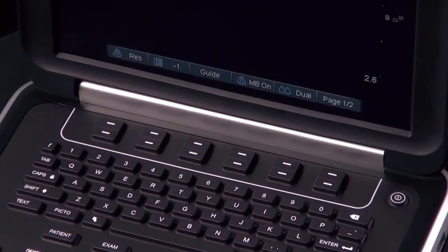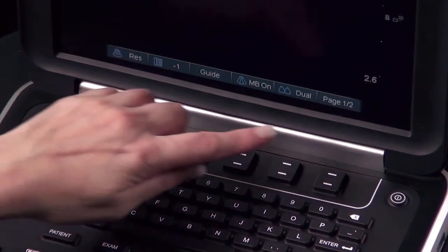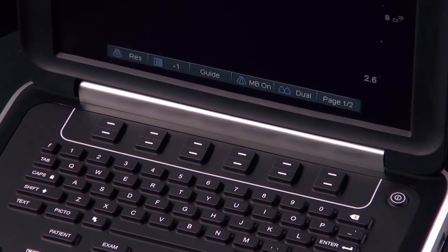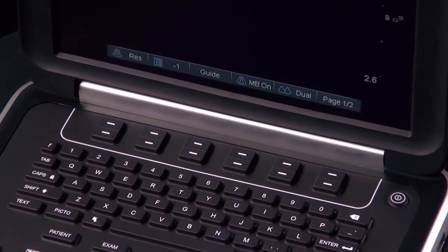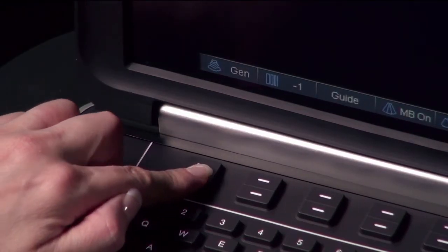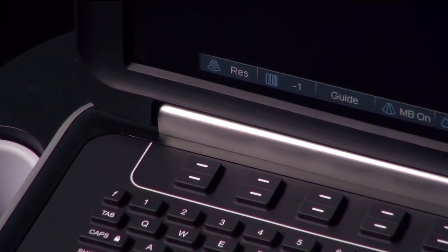At the top of the control panel are a series of six sets of two-button groups. These are the remappable controls, or soft keys. The keys are used to adjust the values of each control displayed in the context menu. The menu displayed will vary depending on the mode or feature activated. When selected, the key will cycle through a list of values, or the up-down function can be used to quickly access the function.